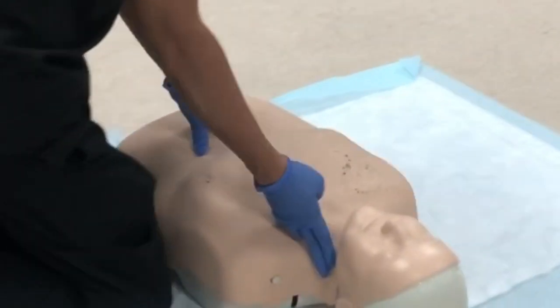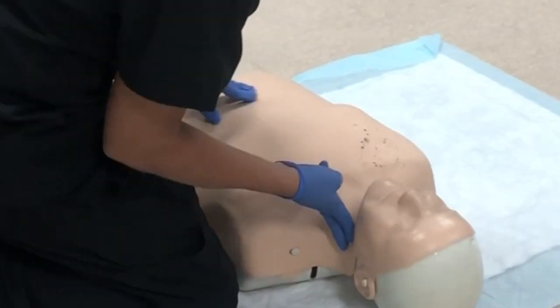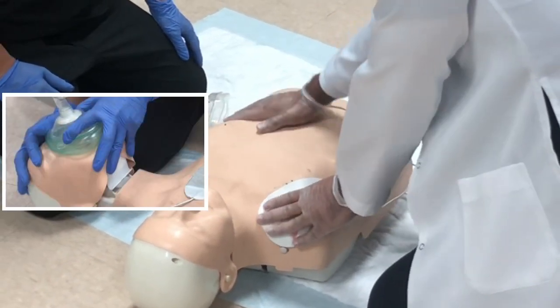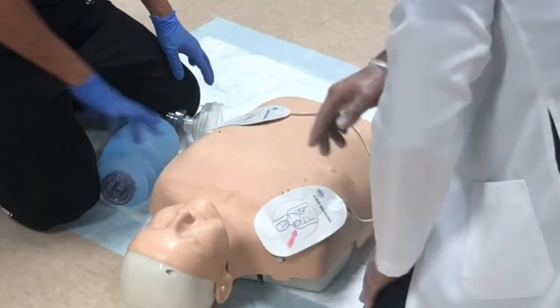Positive pulse, negative breathing. Give one rescue breath every six seconds.